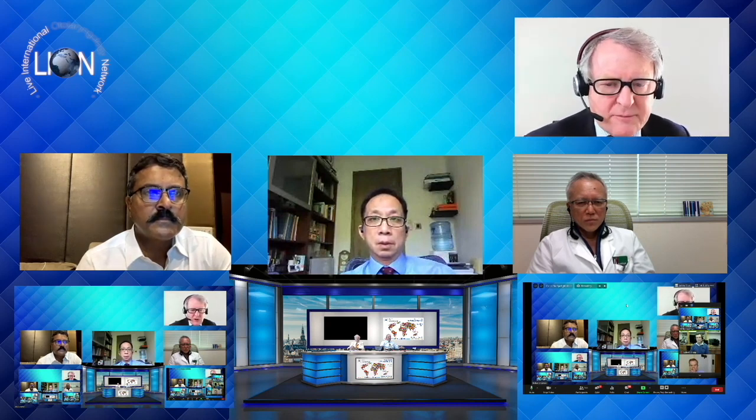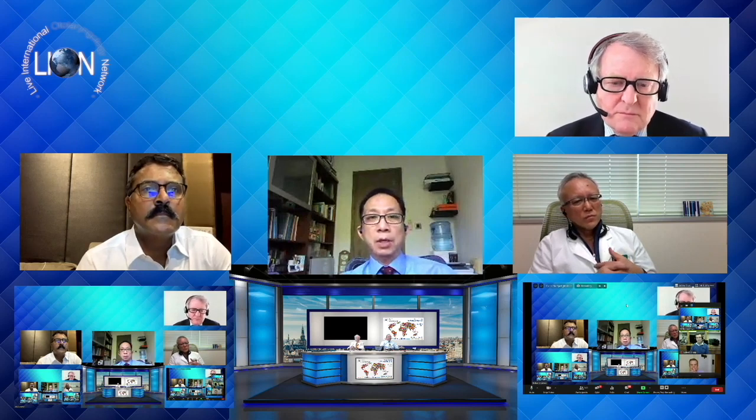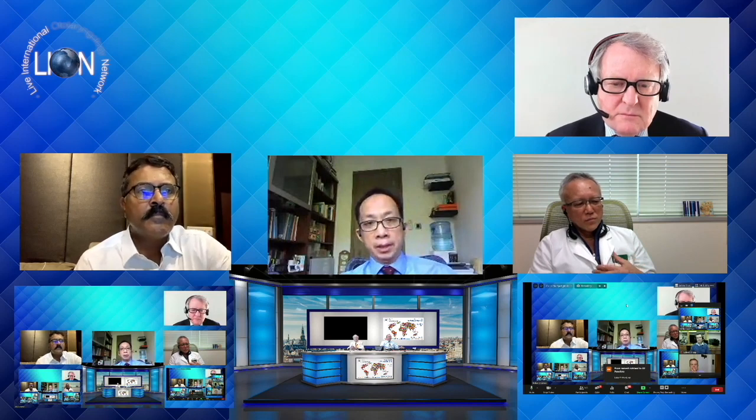Michael, what's the situation in Hong Kong? We use both a canal release incision, which is not really an endaural incision. It's very small, less than the endaural incision. Because we do have more tortuous and narrow canals in Chinese, I'm not sure the Japanese are the same. A lot of our colleagues back in Beijing use post-auricular approaches, which I've never done. I've actually changed to endoscopic assisted techniques now. Seiji also elaborated that this is a one-hand surgery, so it needs a bit of adaptation and preparation. But it does save the canal release incision for our patients after changing to an endoscopic approach.